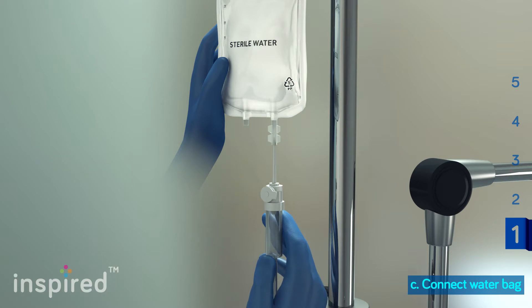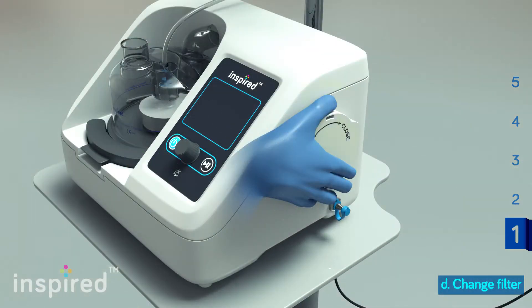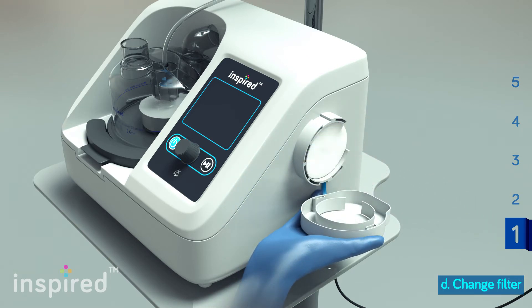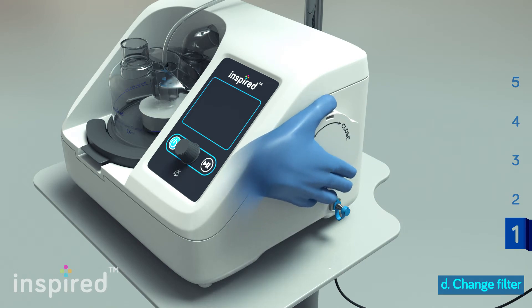Insert the water spike into the water bag. Make sure to open the pressure release valve. Rotate counterclockwise to open the filter cover. Place a new filter in the chamber. Rotate clockwise to close and secure the filter cover in place.